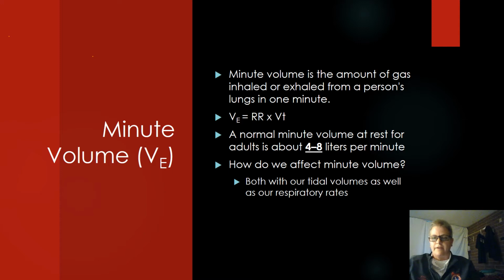How do we affect minute volume? Both the tidal volumes as well as the respiratory rates that we input are affecting minute volume. We can't have an adult have a minute volume of 3 liters. That would be improper vent settings. So we've got to understand what that is.